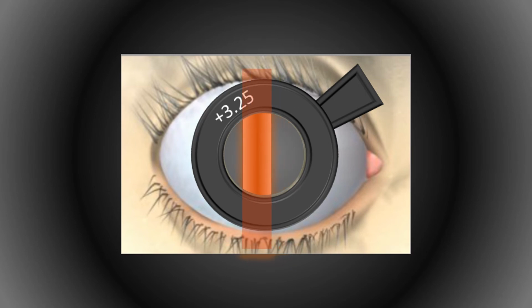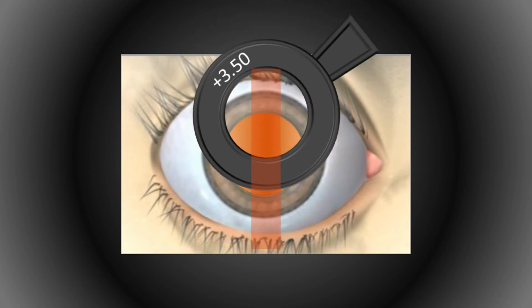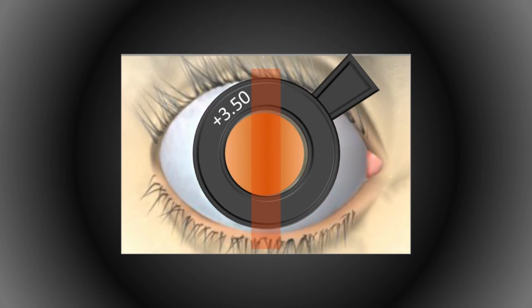Now again check through the +3.25 diopter lens and see the reflex, and it is still "with". So remove the +3.25 and put a greater power and check again. Now with plus 3.5 diopter, it seems to be neutral, a very bright reflex filled in the entire pupil. Now rotate the streak 90 degrees away from this meridian.